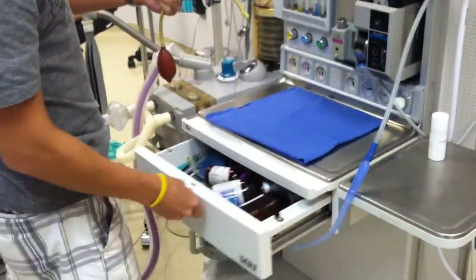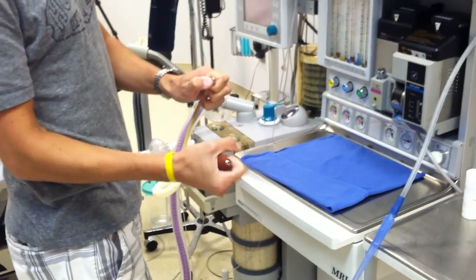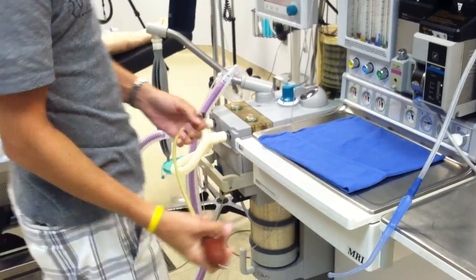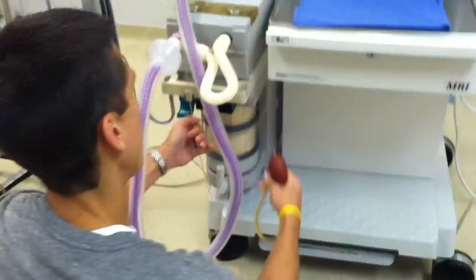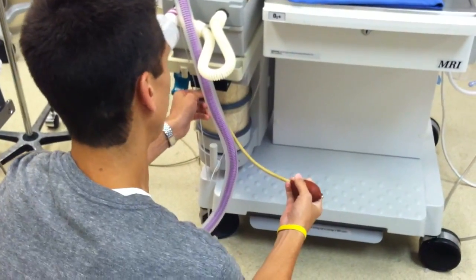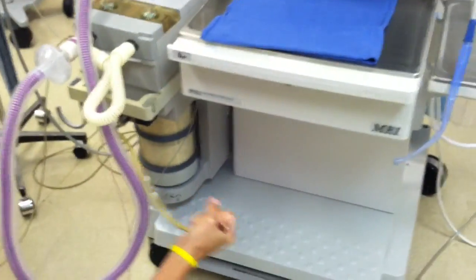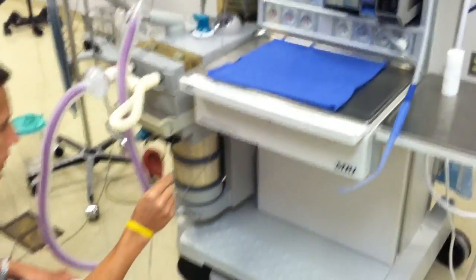While I'm in here, I'm going to grab my bulb for my low pressure check. I'm going to take the end and occlude it with my thumb, squeeze it, and make sure it can stay closed. Down here, I'm going to pull down this green lever and put the bulb into the auxiliary common gas outlet. Squeeze it and get all the air out of the low pressure system, making sure it holds for a minimum of 10 seconds — which it does.